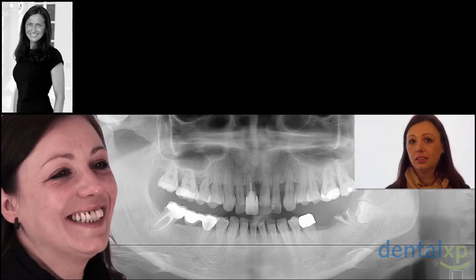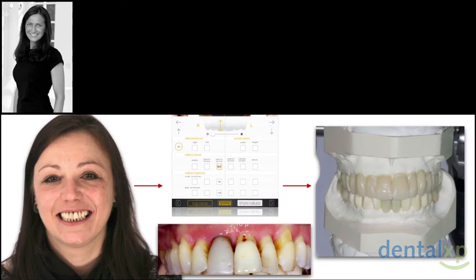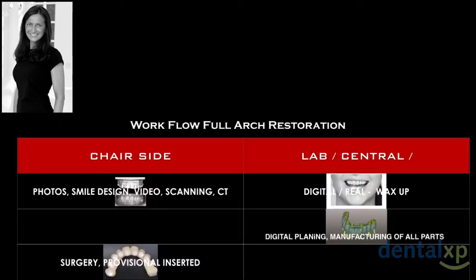This is a young lady who needs a full arch reconstruction in the upper jaw. Now, we do a designing of her smile with a method which takes actually 5 minutes, and this is the basis for the wax-up, which is the basis for a digital planning afterwards.